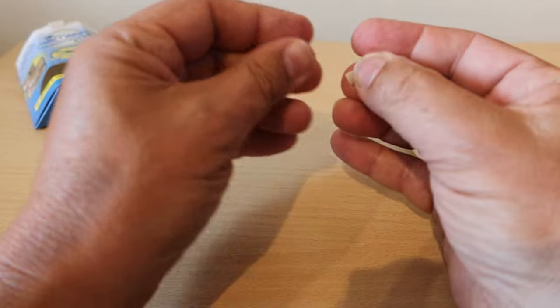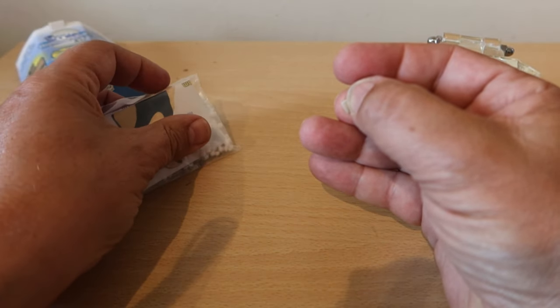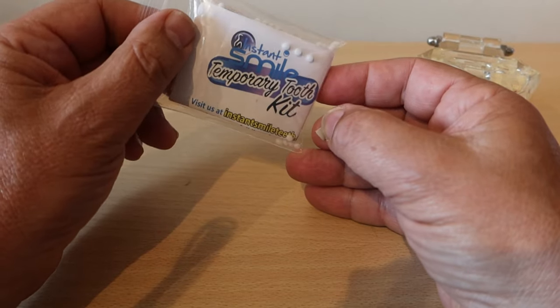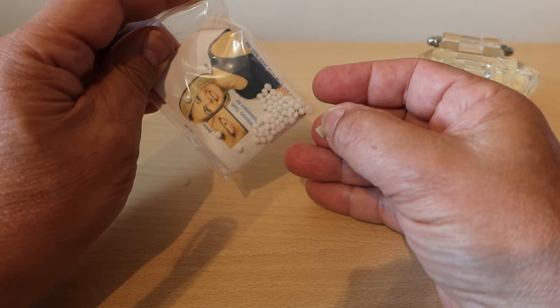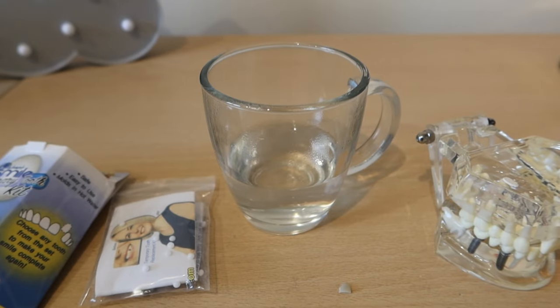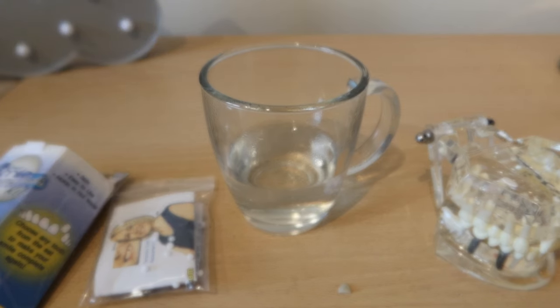The other thing you're going to find in the pack is a packet of thermoplastic beads. These are beads that become malleable — they become soft and gum-like when they're warm — and that's what we're going to use to stick this tooth temporarily in position.